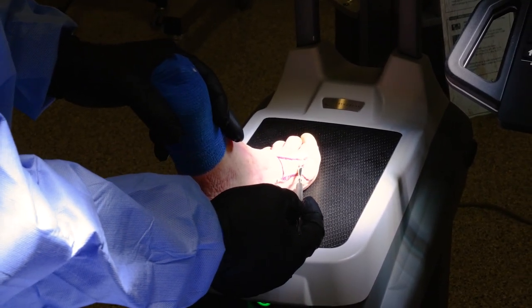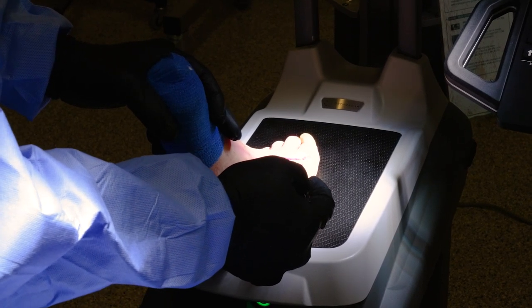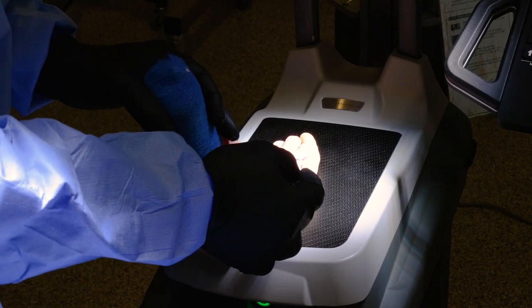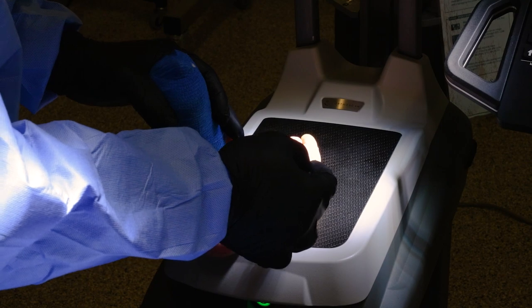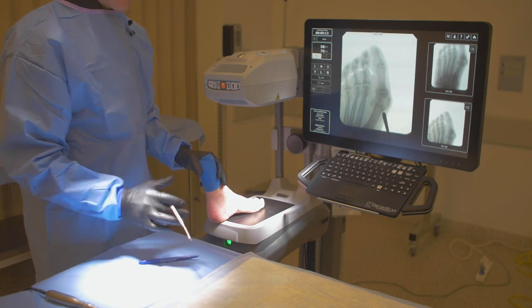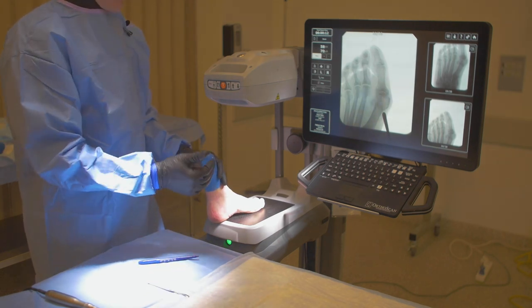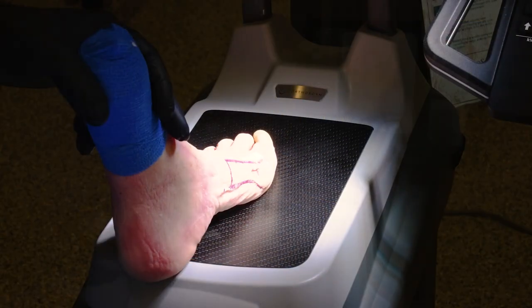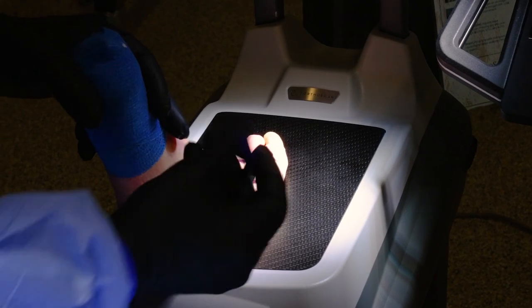I'm going to be a little bit more dorsal, take my fluoro shot, and that's about where I want it — the metaphyseal flare. Becky Serrato did a good paper recently looking at where the capsule inserts and understanding how far back you have to be from the center of the head. This is an extra-articular osteotomy: you don't want to go too distal or too proximal. You have to get your screws in a good position and have enough lateral cortex.